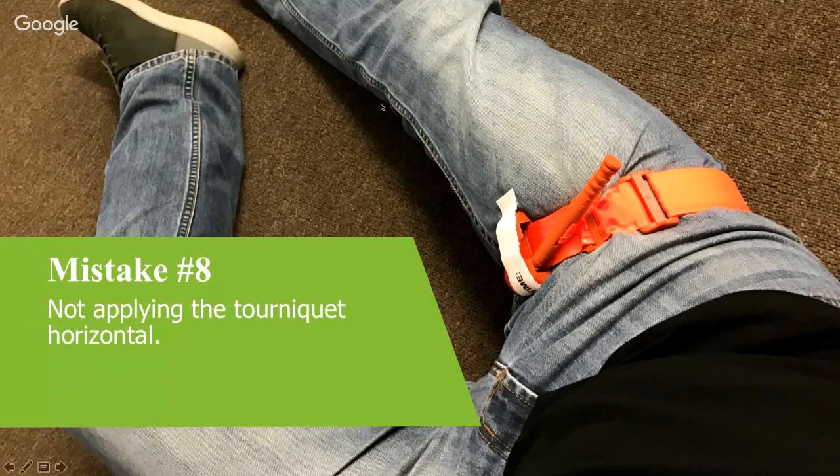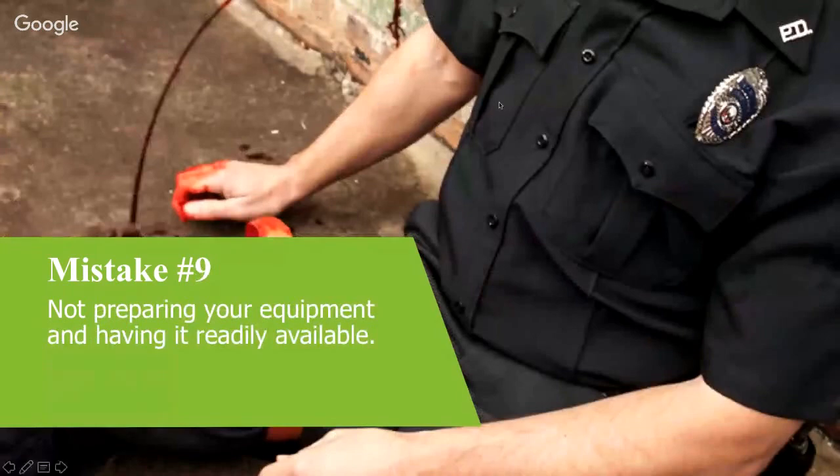All right, so mistake number 9 is not preparing your equipment or having it readily available. So, I mean, this big one is, and Dan, we were talking about this earlier, that at some stage in deployments to Afghanistan with the Australian military, they enforced or directed you to have your tourniquets, the CAT tourniquet, still inside its manufacturing packaging, so still within that plastic. So that way they would increase the longevity of the device.